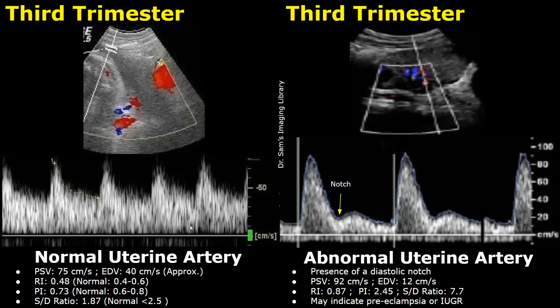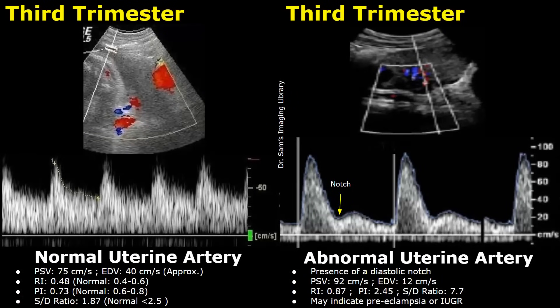The image on the left shows a normal spectral Doppler waveform of the uterine artery during the third trimester, and this image shows an abnormal uterine artery spectral Doppler waveform. A diastolic notch is present. The resistive index is 0.87, which is higher than normal. The pulsatility index is 2.45, which is also abnormal, and the SD ratio is high at 7.7.